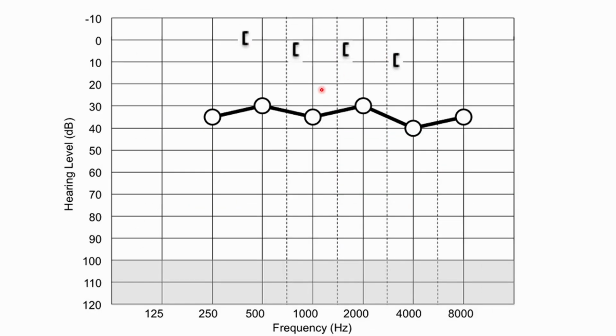Now coming to the second audiogram, again this is of the right side, the circle is showing. If we look at this audiogram, the minimum gap between any frequency is more than 15 decibel. So an air-bone gap is present, and bone conduction is above 20 while the air conduction is below 20. This means that this is a graph of conductive hearing loss. To be precise, we have to take the mean of these three speech frequencies for air conduction, which will be 30, 35 and 30.